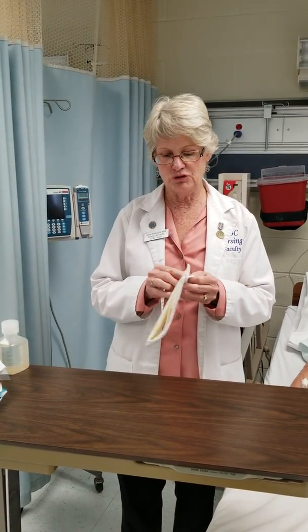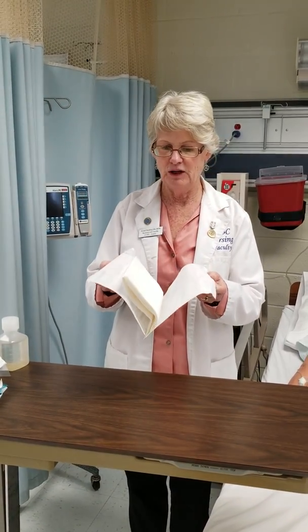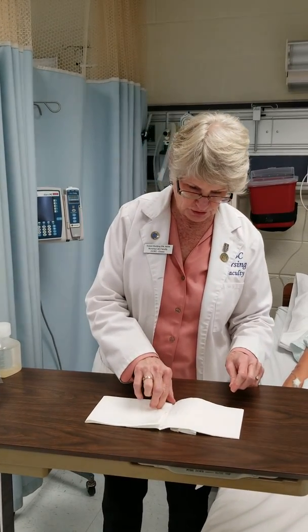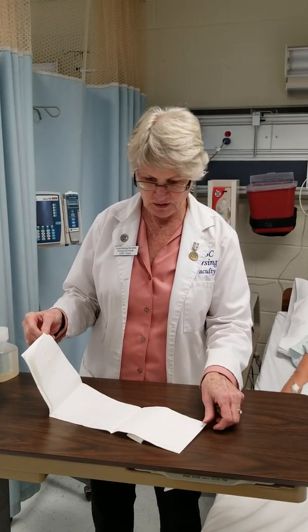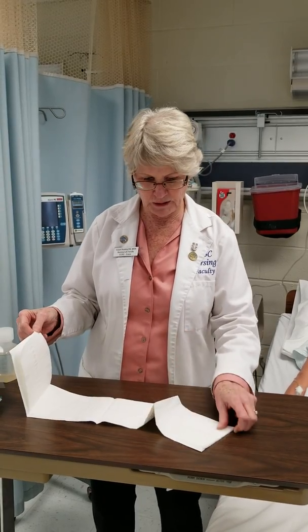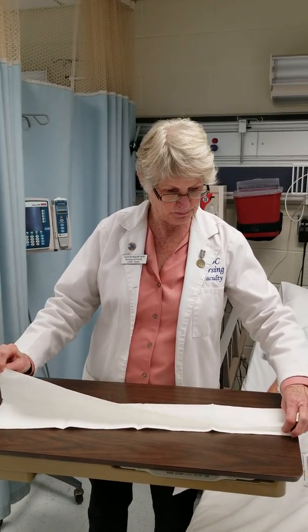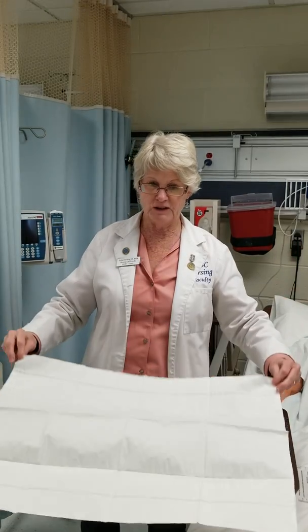I'm demonstrating how to set up a sterile field. I will start with my sterile towel drape and I will open my package, peeling it apart and dropping this directly onto my table and dispose of the packaging. I will open up my sterile drape with the sealed seam side of the drape towards me. This side is the side that will be down on the table. Lifting it at both edges, I'll pick it up and drop it right down.